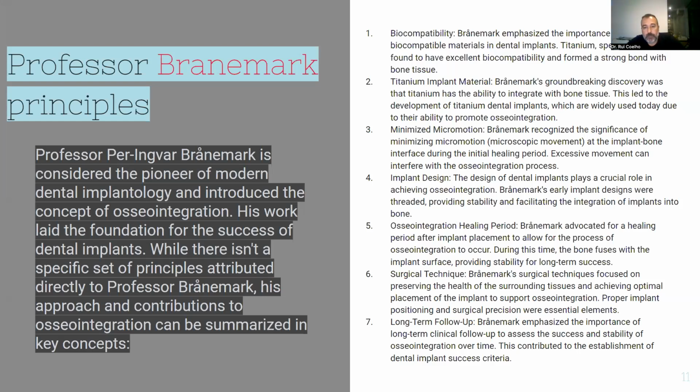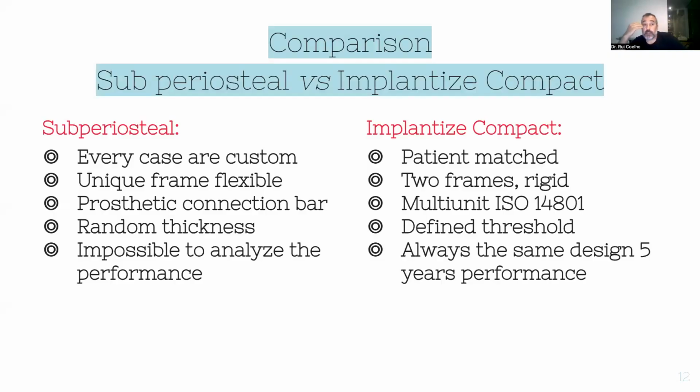And for this description, we have lots of parameters that we have to follow, like micromotion and biocompatibility, a surgery that is not very traumatic, and a healing period. So this is something that Professor Brånemark has brought to us, and it brought us the new era by using osseointegration.